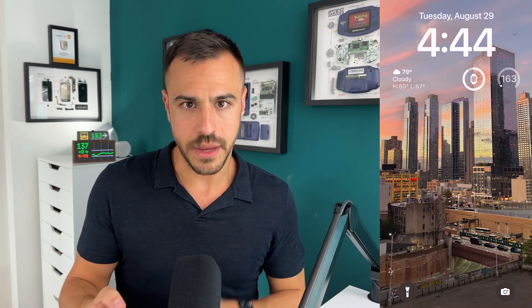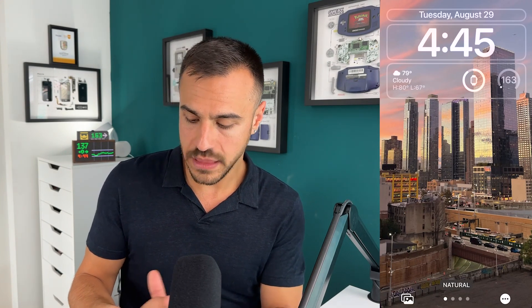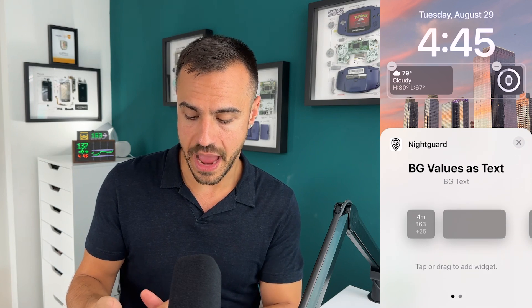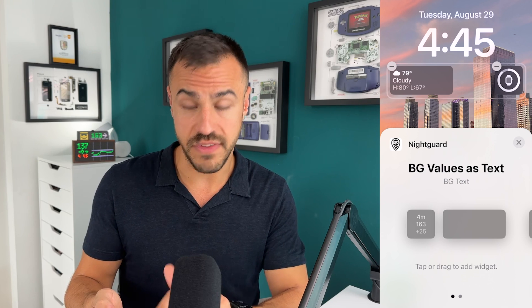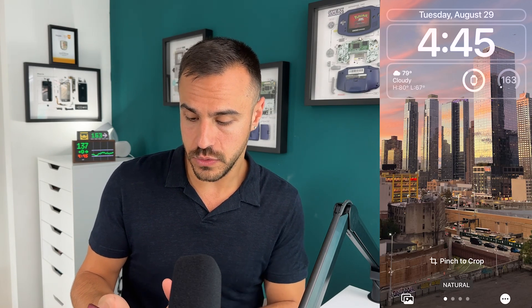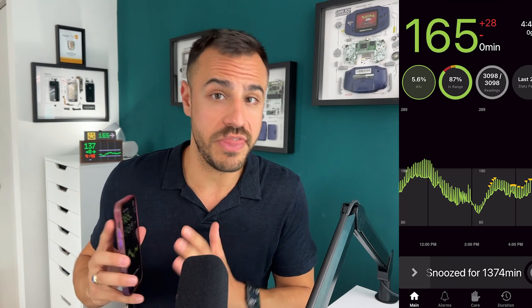There is no official Libre 3 Apple Watch app, so there's also other stuff to do on here — I haven't really played around with it, but if you want to check it out, there's a lot more to do. There's also the ability to put a widget on the home screen. Hold down on the home screen and click Customize, then go to the lock screen — this is where you can put widgets. You can go down in this list and go to NightGuard, then add. You can put BG value as text or BG values as gauge — I like the gauge. And then there you go, you have it on your home screen. You can open up the app just by tapping that widget.